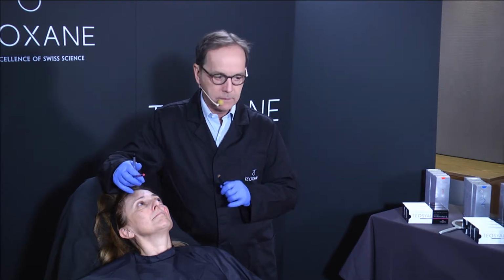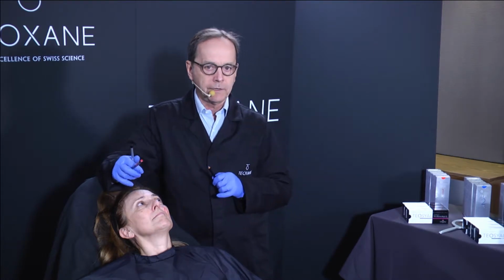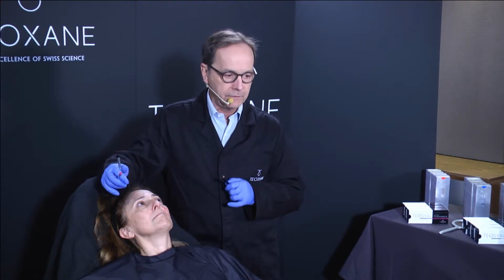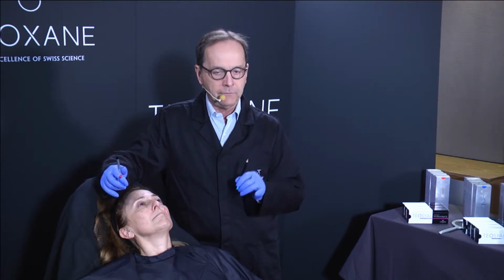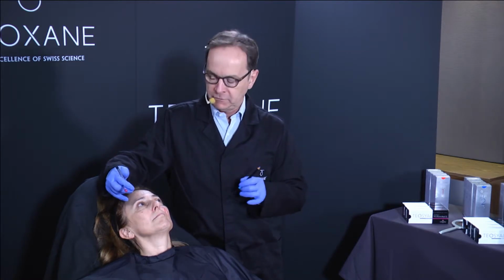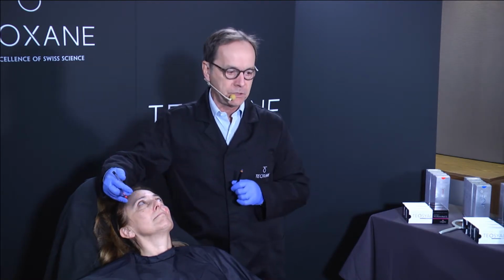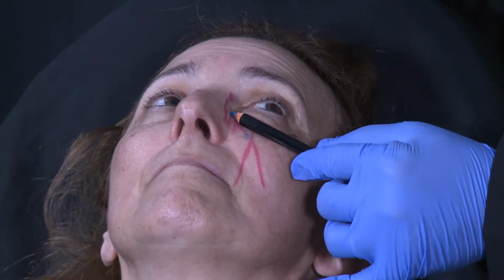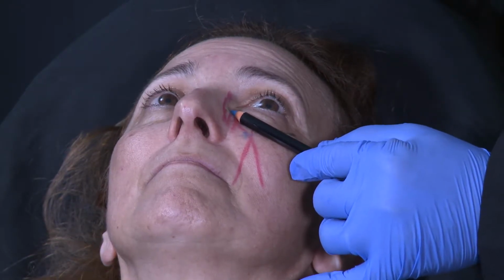No, not at the second time. I never inject two planes in this area at the same time. I don't want to have any swelling. So first, safety first. I want to sleep. I know how you are, sad and tired if you don't sleep. I don't want a phone call from my patient saying that she has a big swelling, a big bruising. So first I inject deep on the bone, on the bone origin of the orbicularis oculi muscle.